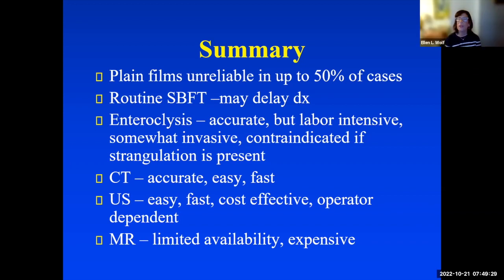Yeah, we generally don't give oral contrast in the ED as well, unless there's some specific reason that they want to have it. In rare cases, we'll have to repeat it with oral contrast because it's unclear whether there's obstruction, whether it's ileus, whether it's something else. But in most cases, oral contrast is not necessary, and it can be harmful because it can lead to aspiration. And it's generally, in most cases, not that helpful.